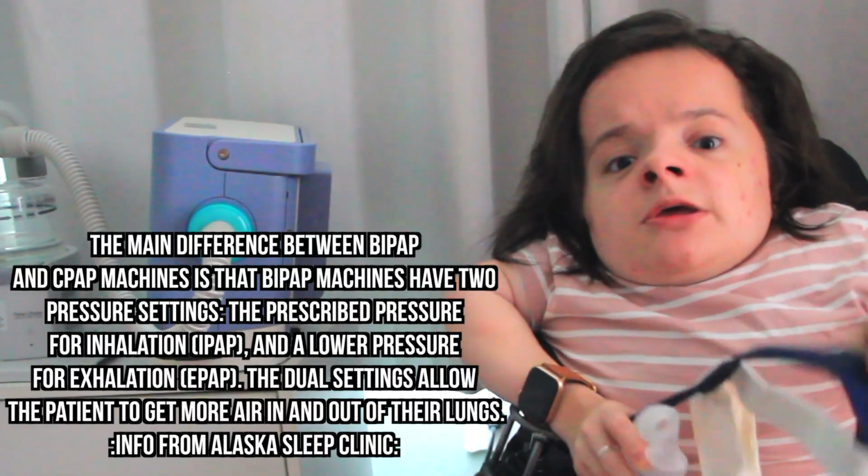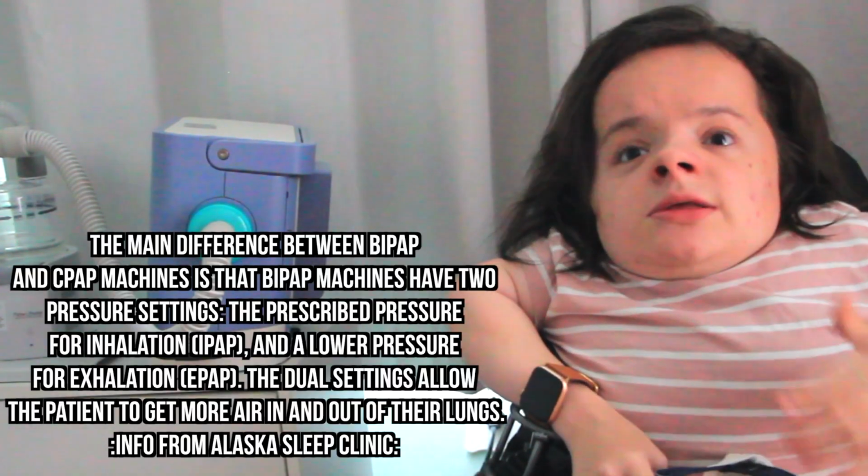It's insane that it took 9 sleep studies for me to get diagnosed. Many people use different things. I use a trilogy, but there's CPAP, BiPAP. CPAP is where it continuously pushes air in you, it doesn't stop. Where BiPAP, it breathes in when you breathe in and it breathes out when you breathe out. It's more natural, and I just couldn't tolerate the CPAP.